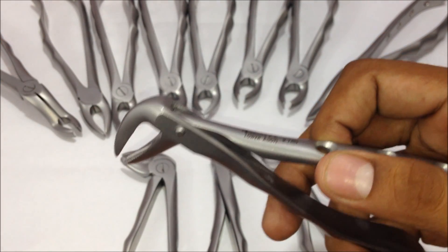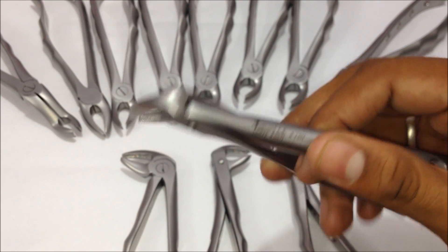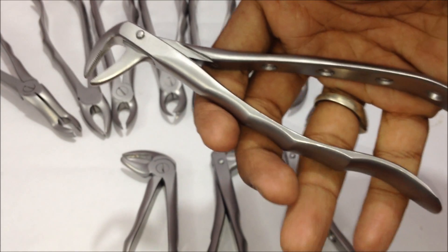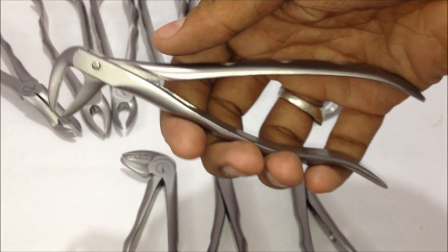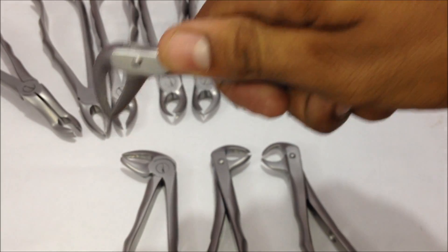For the lower teeth, this is the number 74 forceps, used not only for roots but also for lower anterior teeth. Here are the depressions where the fingers are placed — this is how you hold and pull out the tooth.